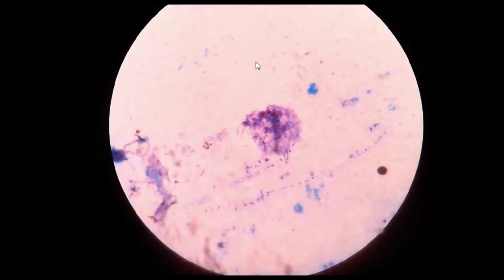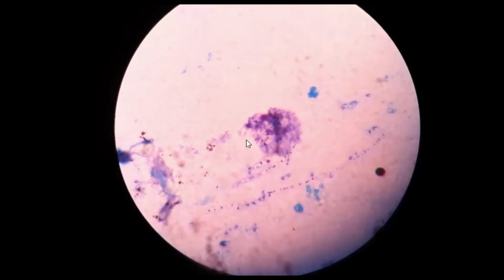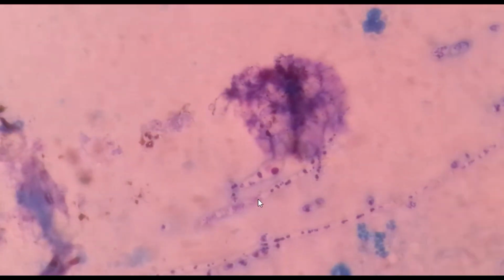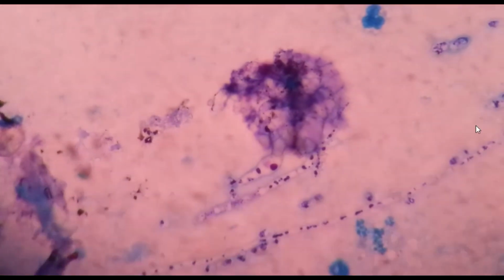And these types of structures were seen. Here we can see nocardial structure, this one, partially acid fast, isn't it? So let's watch the full clip. Here you can see partially acid fast, this one.